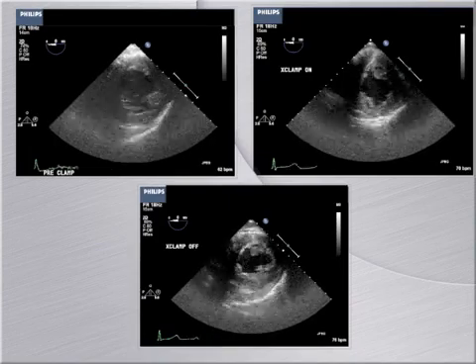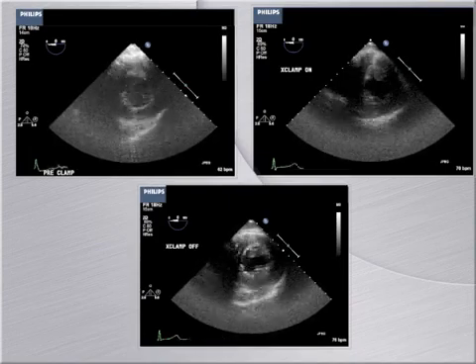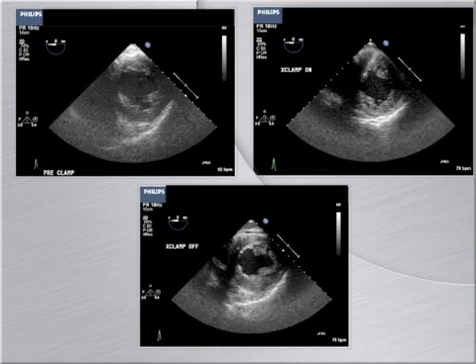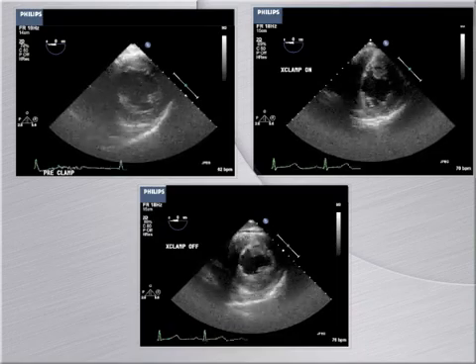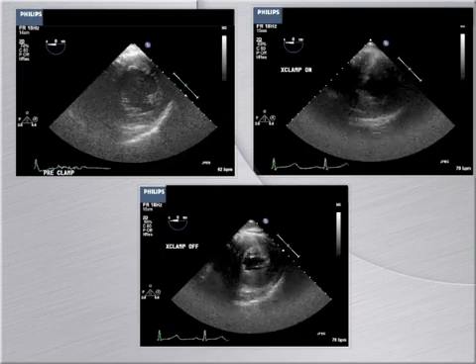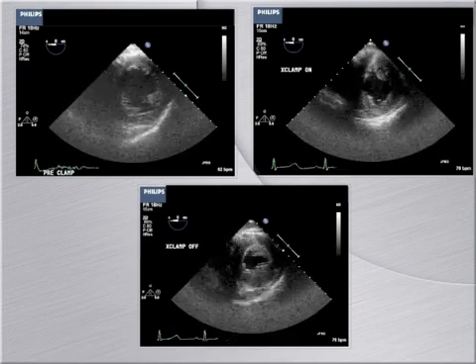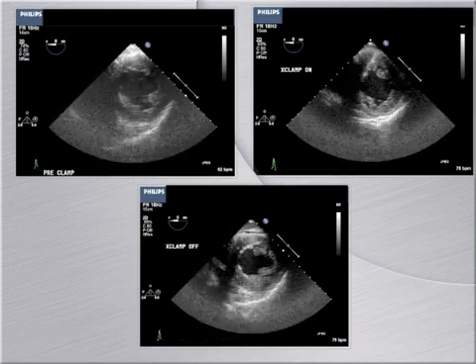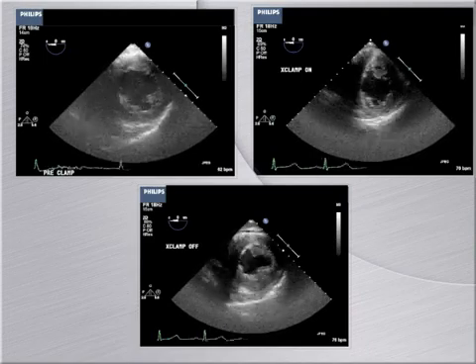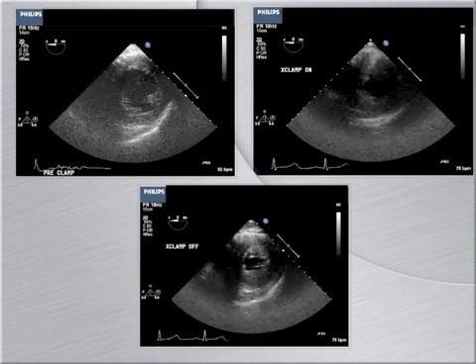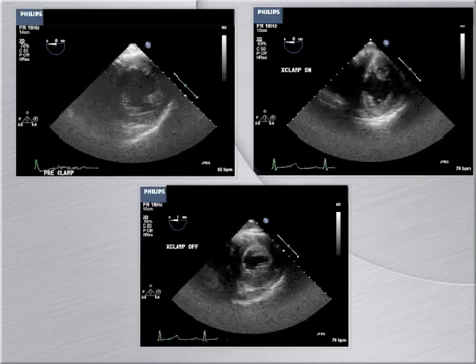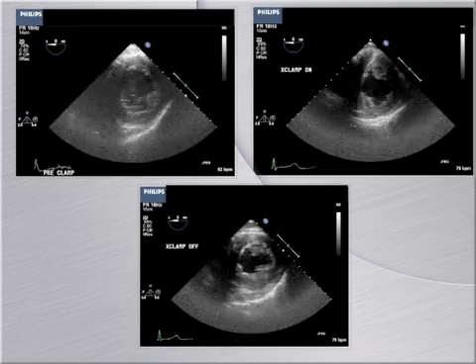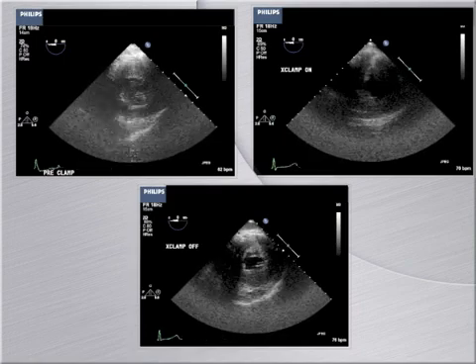This series of images depicts the impact of sudden increases in afterload on the myocardium during application of a cross clamp for aortic surgery. On the top left, we see a normally functioning myocardium with an ejection fraction greater than 55% and normal wall motion. On the top right, a cross clamp is applied and the heart becomes hypocontractile with an ejection fraction of roughly 40%, with an increased LV end diastolic diameter suggesting lower cardiac output against the high afterload. The bottom image shows the return to normal function after the cross clamp is removed.